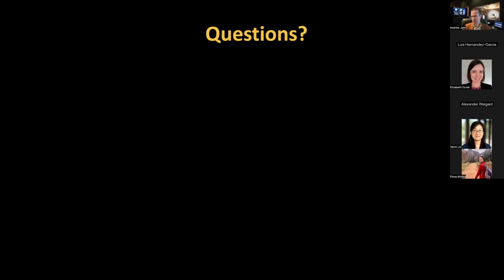Is it set up to do the segmentation and the layer specification from the fMRI data itself, or is it from structural images? Yeah, in the paper they recommend using other segmentation tools. So I think one of them was one of Suma's, I believe, segmentation tools. I don't know about FreeSurfer, for example, but maybe ANTs possibly.